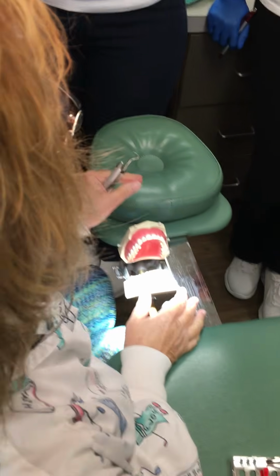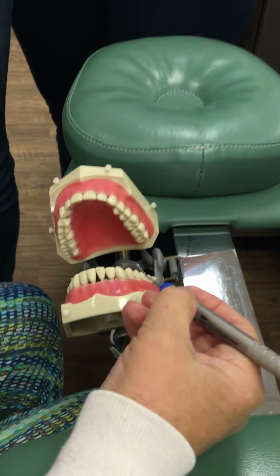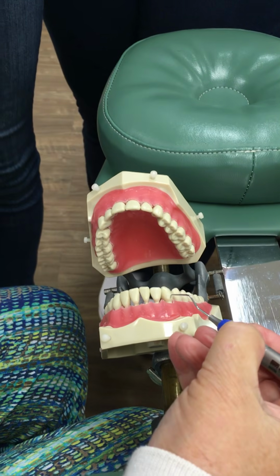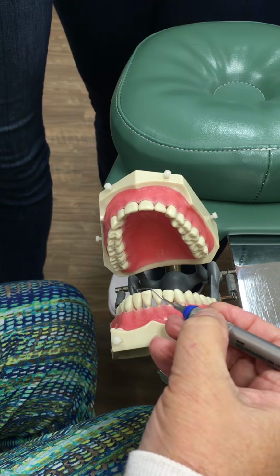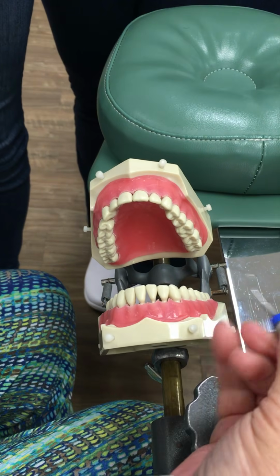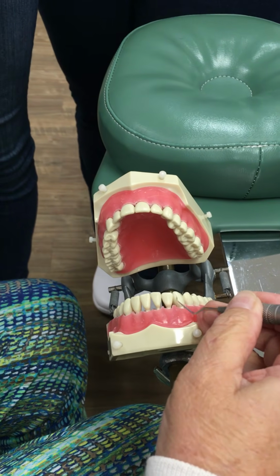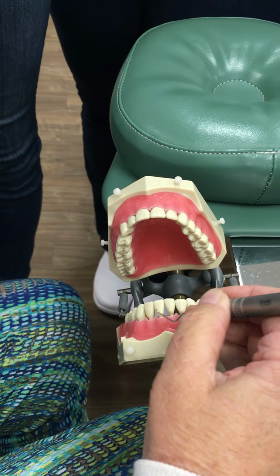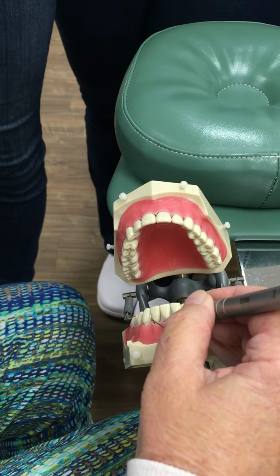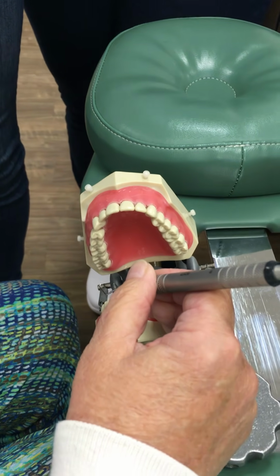Things are going to change up with areas 1 and 2. And we talked about in class, in the anterior, we divide the tooth into half. You remember that? Okay. And that part of the tooth that is toward us, or toward me, on each tooth, is considered the toward direction of the tooth, the toward surfaces.